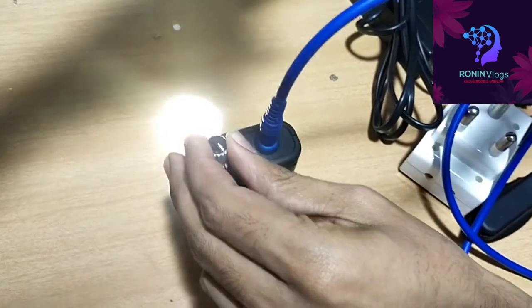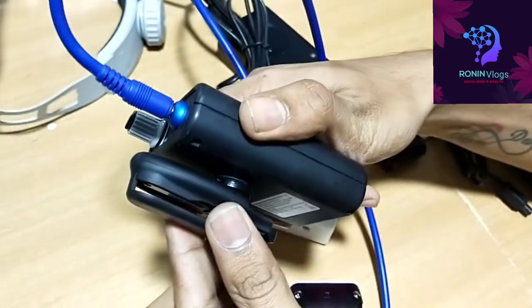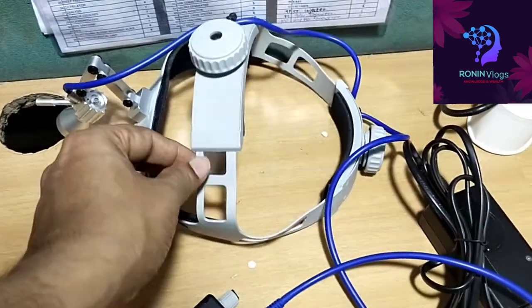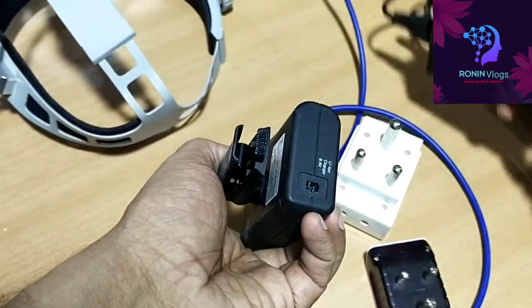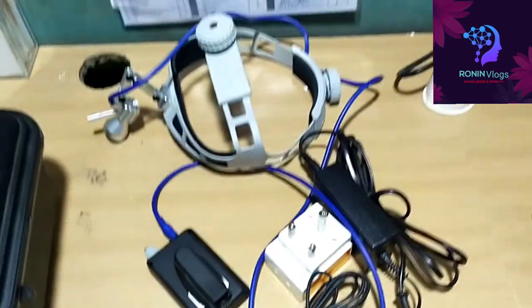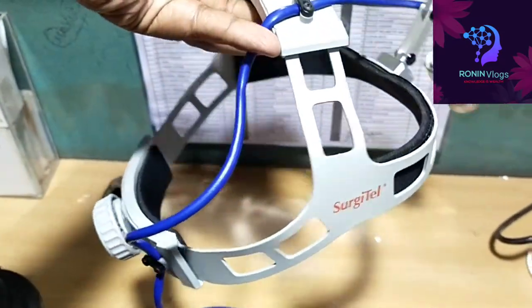Just need to rotate. This is the place on the downside where the charger will connect for charging. Two hours charging is needed. It's easy to use and also lightweight — comfortable for the doctor using this during surgery.